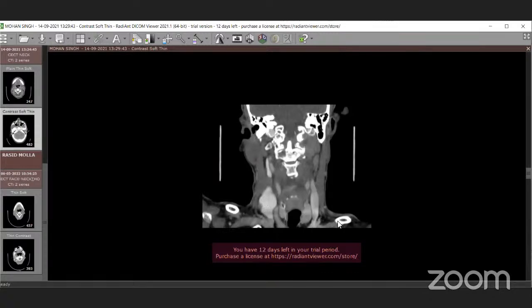Fine. Might be in the next class, if we have some thoracic cases, you might show all these things, isn't it? We will take up some thoracic cases. Yes, definitely. Next, we'll move to the transverse cervical.